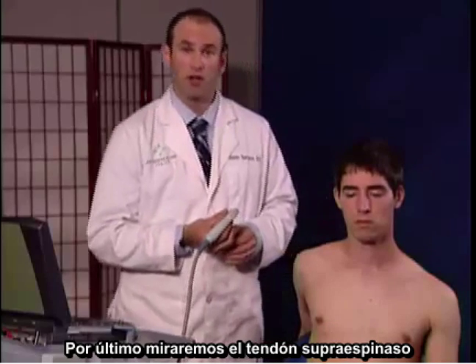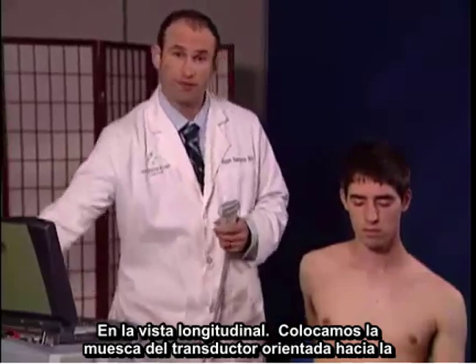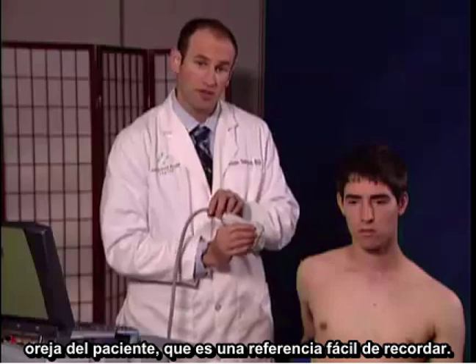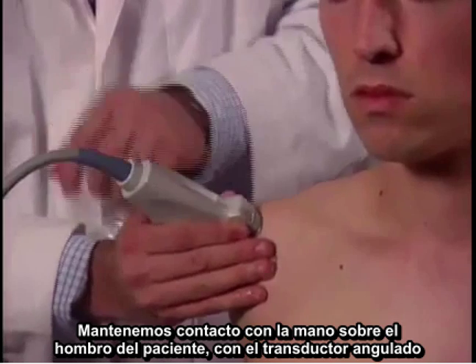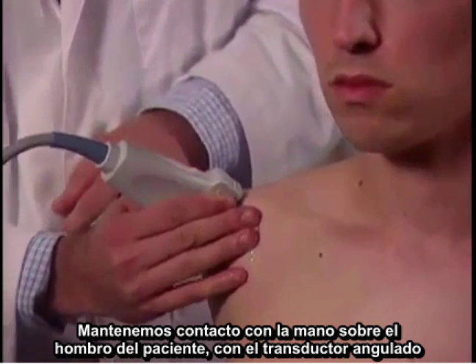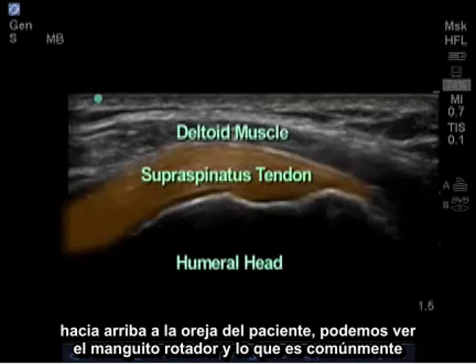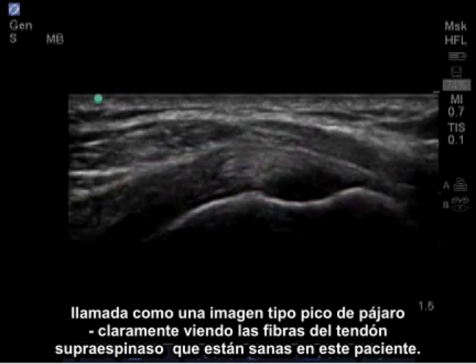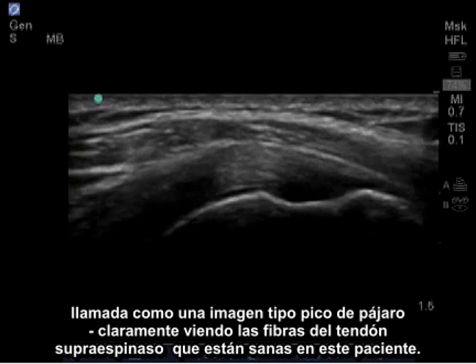Lastly, we're going to look at the supraspinatus tendon in its longitudinal view. I place the notch of the probe facing towards the patient's ear, which is an easy to remember landmark, maintaining contact with my hand on the patient's shoulder with the probe angled up towards the patient's ear. We can see the rotator cuff in what's commonly referred to as a bird beak type image, clearly seeing the fibers of the supraspinatus tendon, which are healthy in this patient.